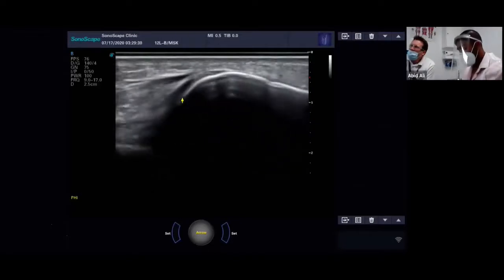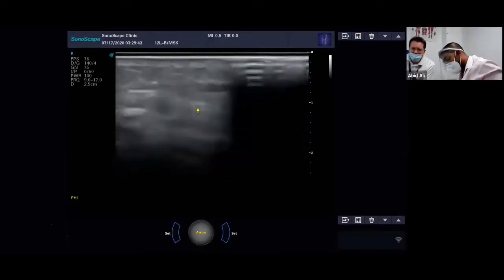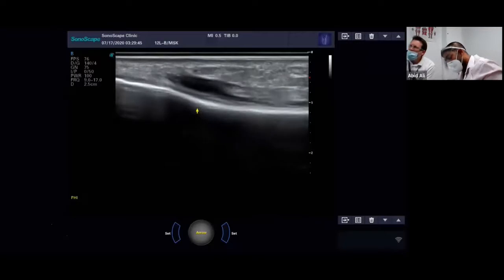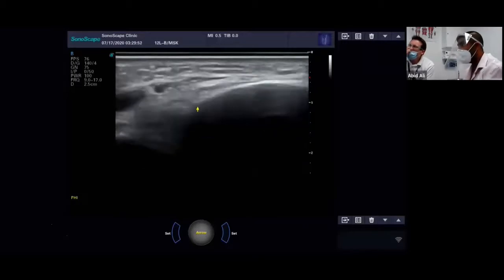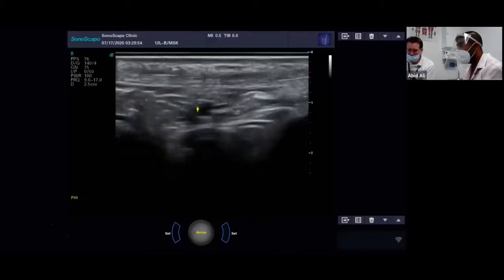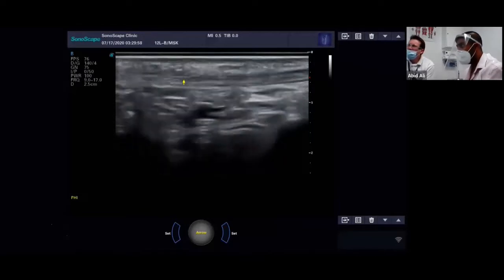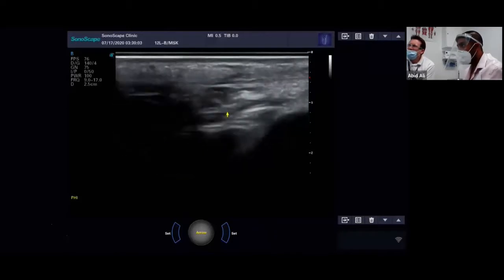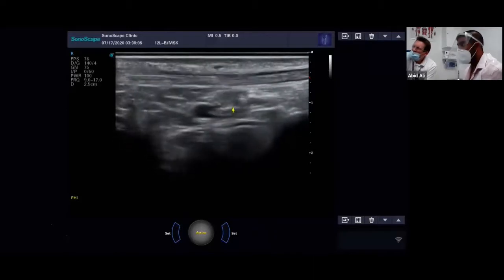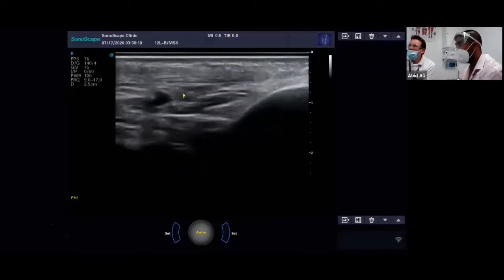We'll ask Adrian to dorsiflex his ankle. And you can just start to make out here the Tibialis Anterior. You should be able to palpate it. And that makes it much easier to get your probe onto it. So there you go, there's your Tibialis Anterior. It's very interesting to be able to view it dynamically. So let's follow this and see if we can go to the insertion.